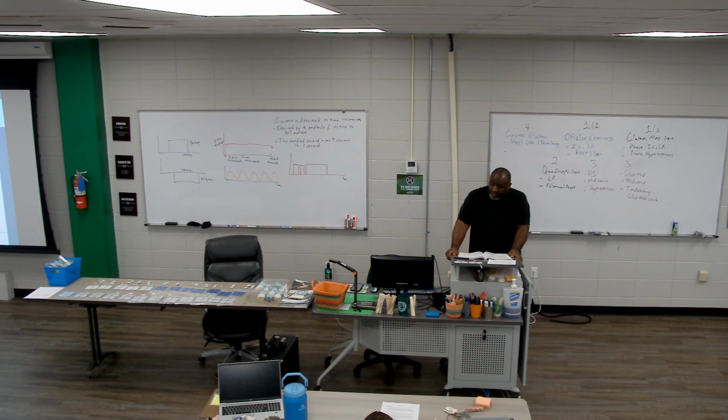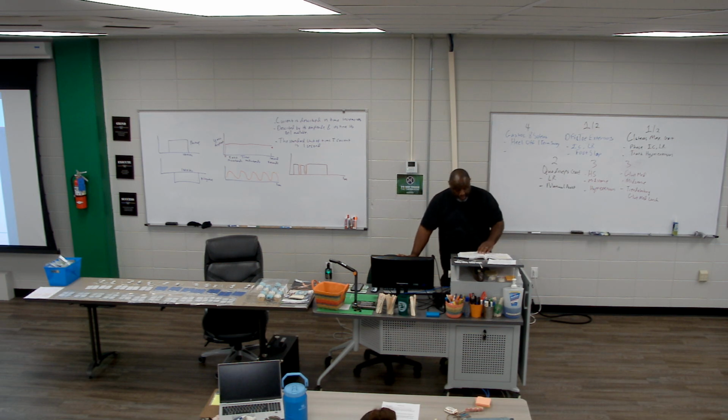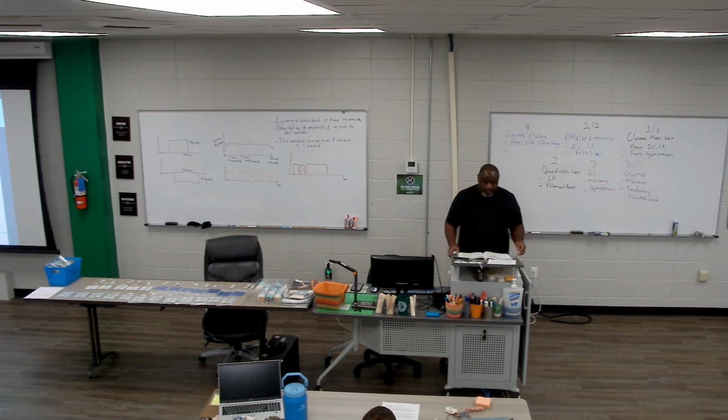All right, so that's amplitude. How much? The next thing we have the ability to adjust is going to be phase duration. Well, let's jump to frequency. Then we'll come back to phase duration to make it make sense. So jump to 286 and let's talk about frequency.